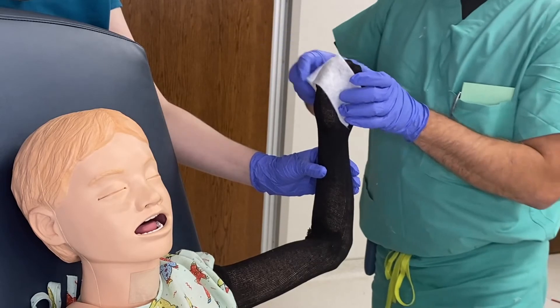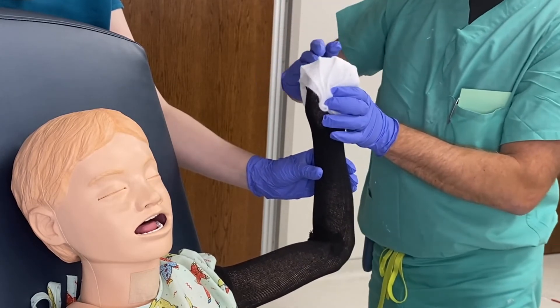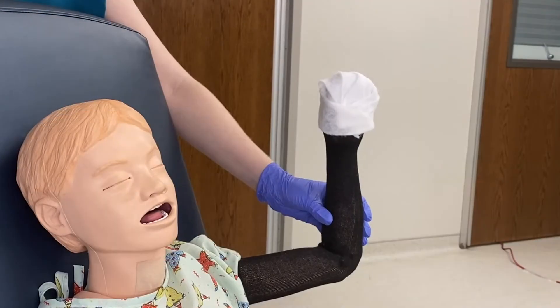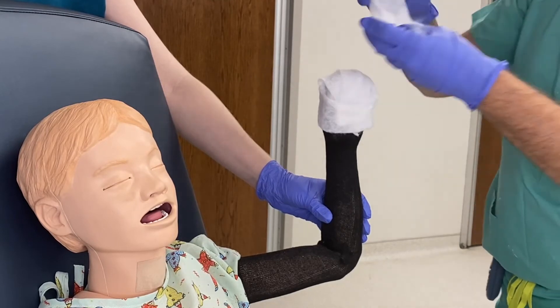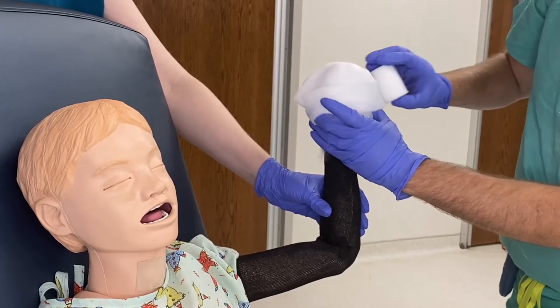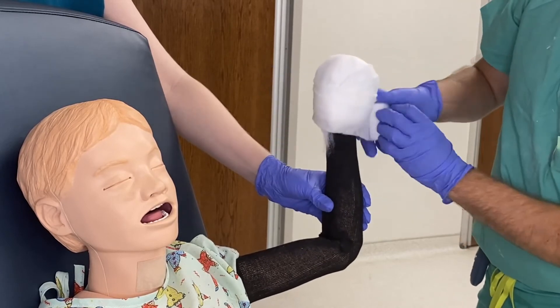Start with the fan fold and you want at least four layers. You can either go back and forth or you can go lengthwise — for teaching purposes I'm going to show both ways. Now that we've rolled this way, we're going to roll the other way. It's 50-50 on top when you do the fan fold, and then going down 50-50.